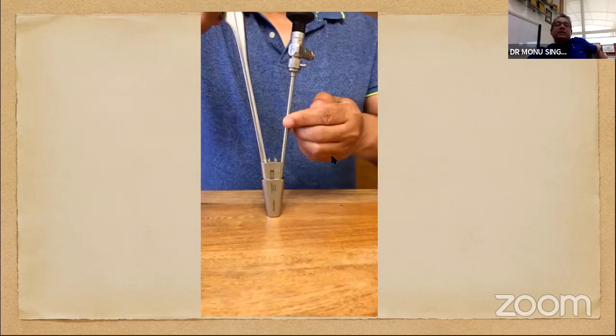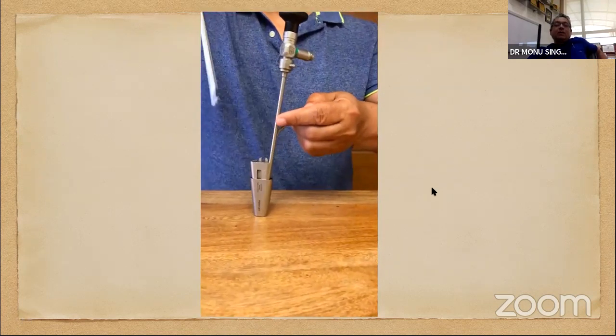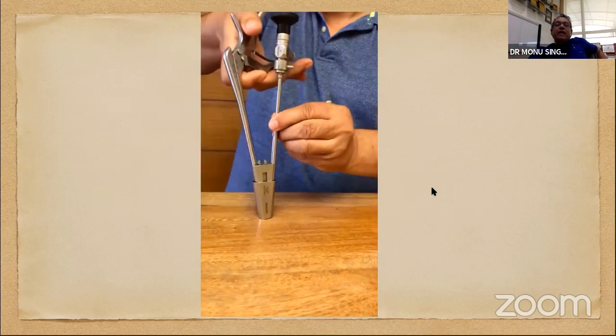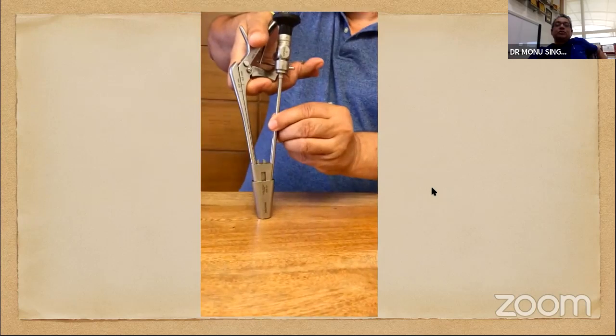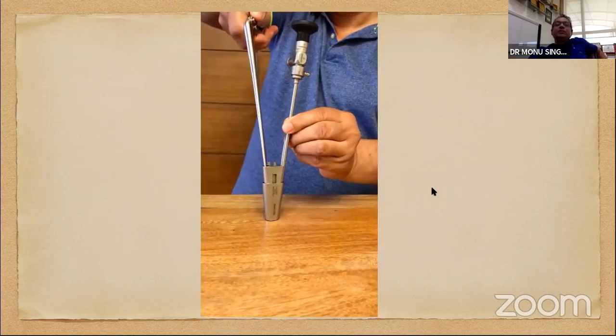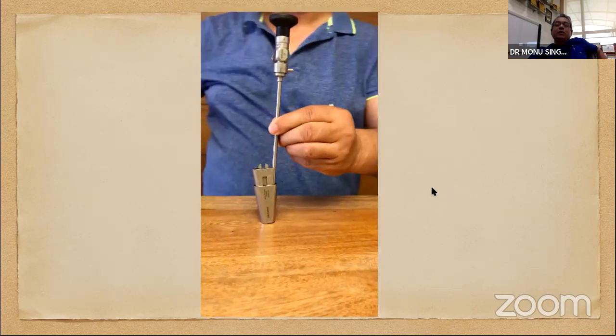Now, this is a short video. If you are right-handed, what happens in a right-sided approach? Your instruments get crowded. As you can make out, it is easier to operate on the left side of the patient than on the right side because the instruments get crowded on the right side. This set is intended for right-handed people. So to start with, stick to left-sided patients. Do a few of those patients with herniations on the left side so that you pick up the technique properly.